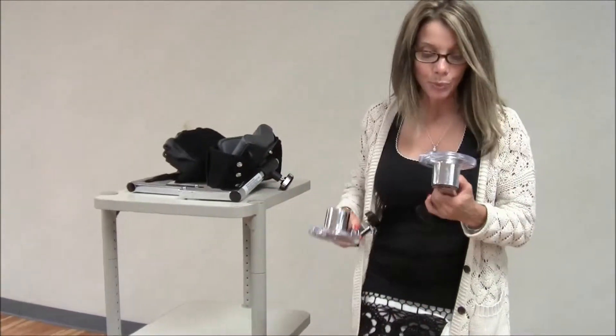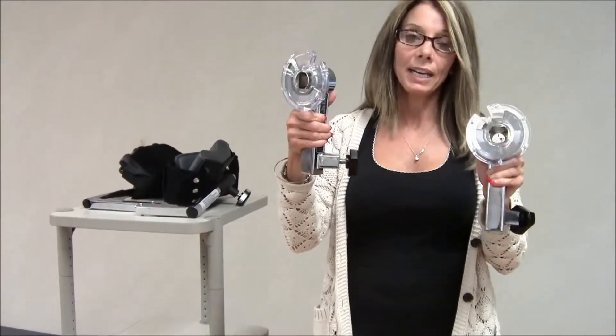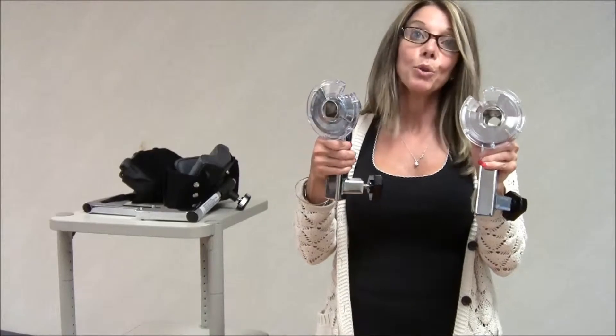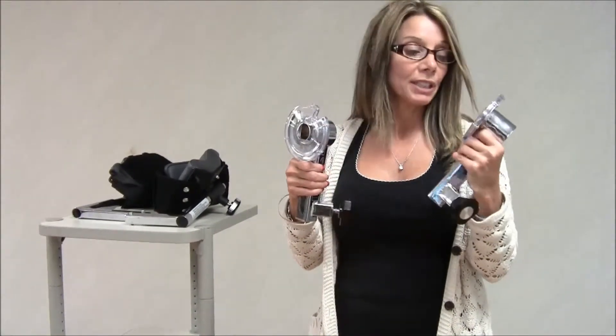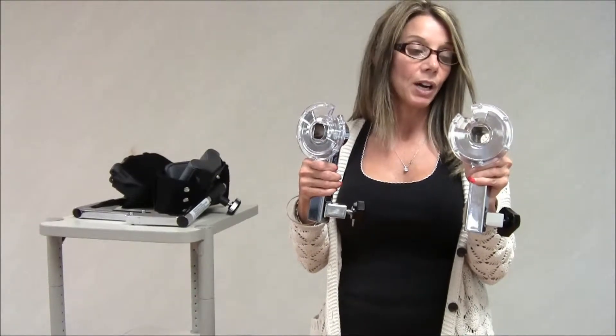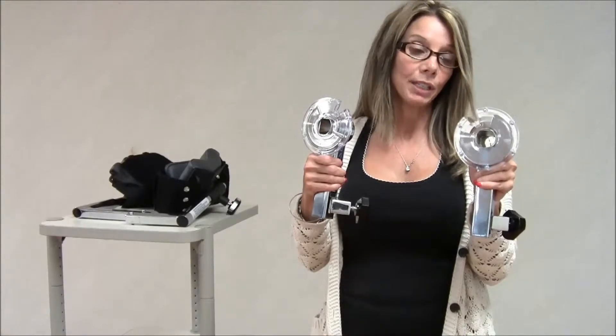Now looking at the input tubes, there's no difference. This is the pediatric in my left hand and this is the adult in my right hand. If you notice, the range of motion stops are very different. The pediatric attachment has a smaller range of motion — it was devised for standing, testing, and training only.